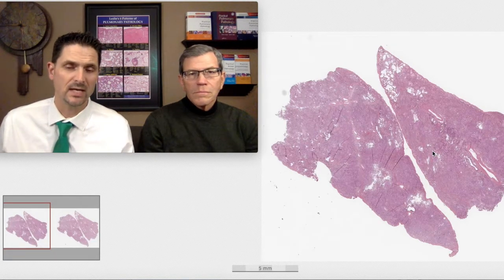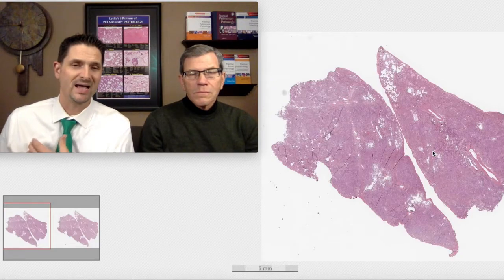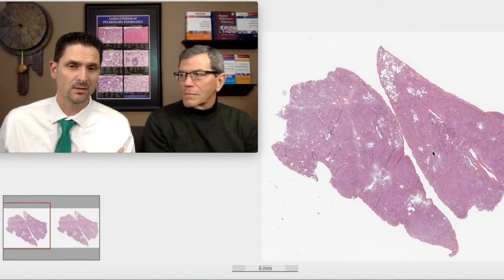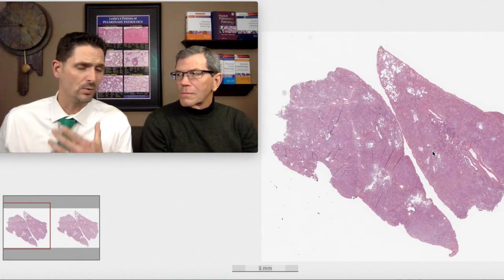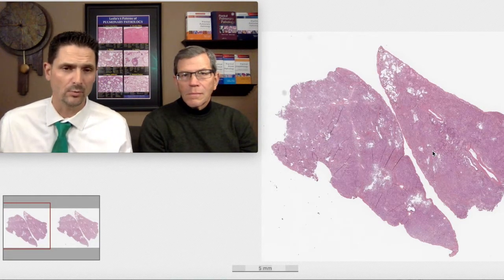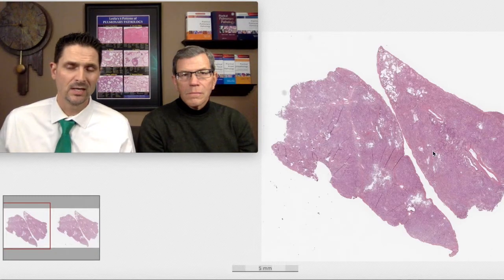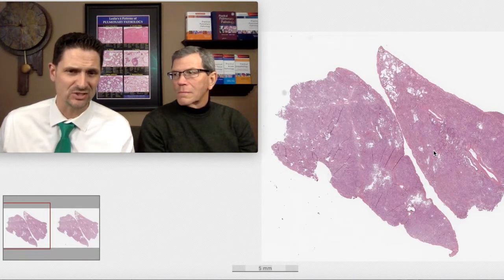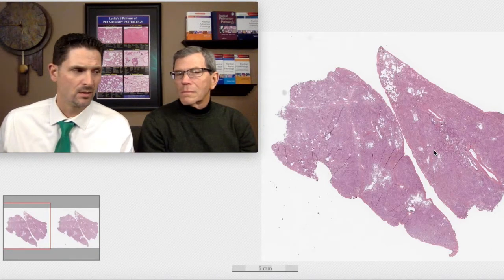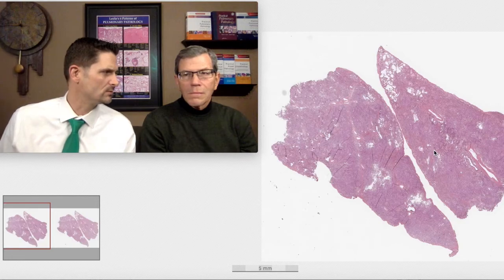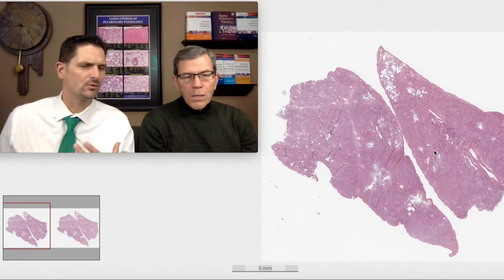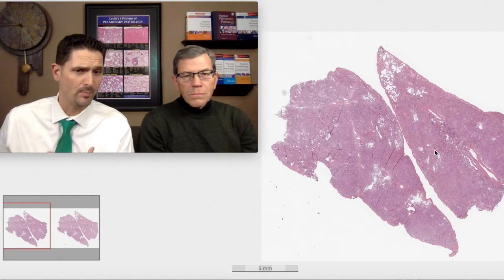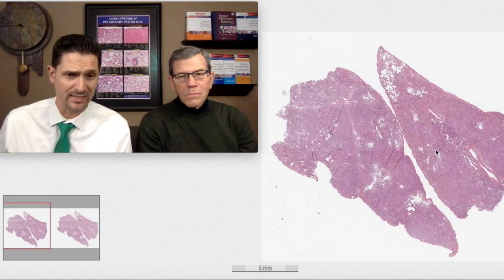Of course, he has a CT scan. He has bilateral ground glass opacities that don't really show an upper or lower lobe distribution, with superimposed areas of consolidation. So: bilateral ground glass opacities with superimposed consolidation — what does that mean to you?